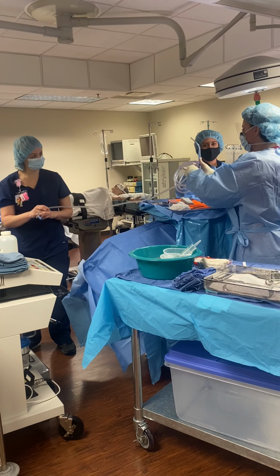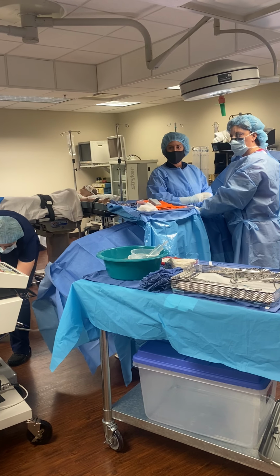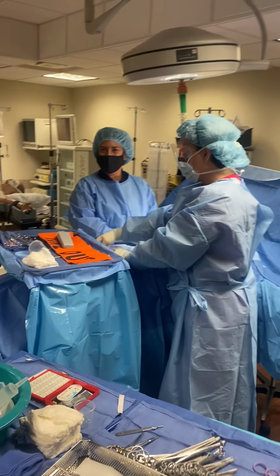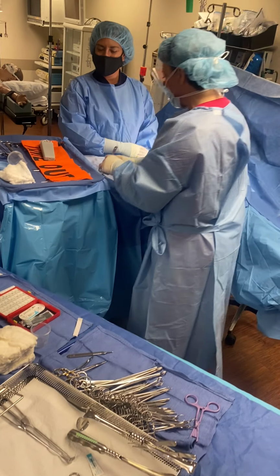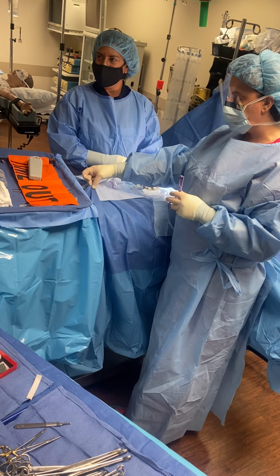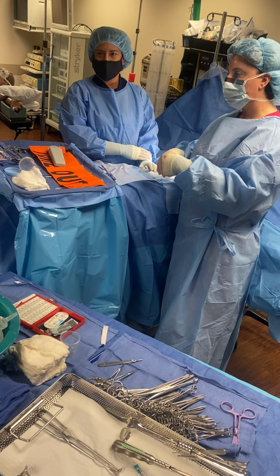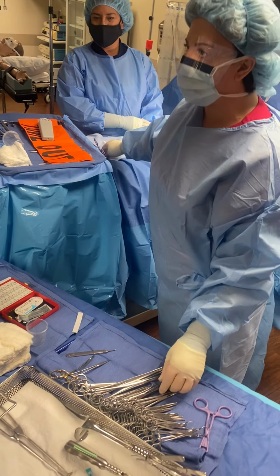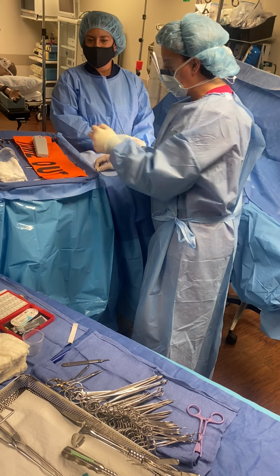Okay, and then I just go under my nail down here, and then you gotta attach it to the field, okay? There's a couple ways. There's this little Velcro dealy bob, which is amazing. If it doesn't have the Velcro dealy bob, you can use one of these fantastic disposable clamps. What you would do is make a little sling with the sheet, all right? And then you would just clamp it. You wanna make sure that you don't clamp the cord, okay? So you could attach it that way. What if you don't have this purple dealy bob? Then you can use an Alice, okay, if you don't have a drape clamp, all right? But we're just gonna use the Velcro because the Velcro is so amazing.